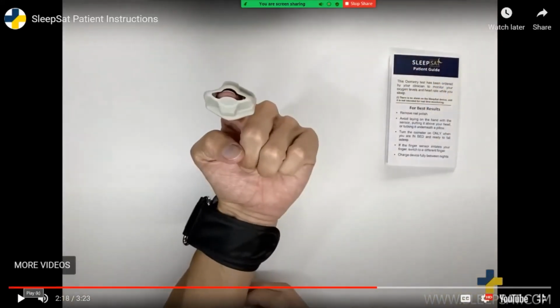This is a good opportunity to point out what that means exactly. There's a small tab on the end of the probe. Push your finger in until it barely touches that tab. Your finger should not be laying that tab down, and it also shouldn't just be floating in the middle of the probe. That's going to get the best results of both recording and fitment.